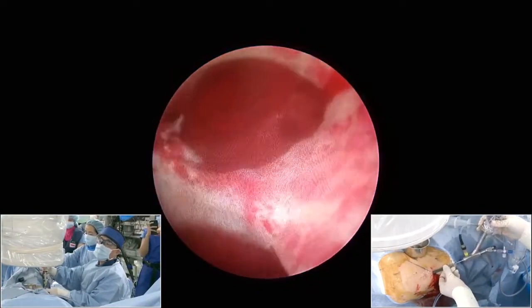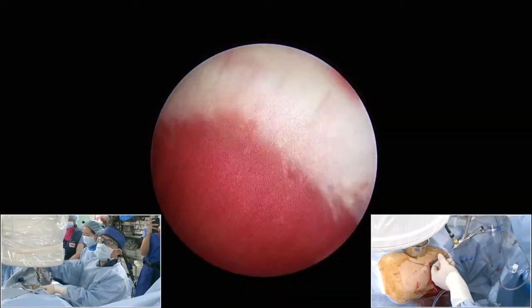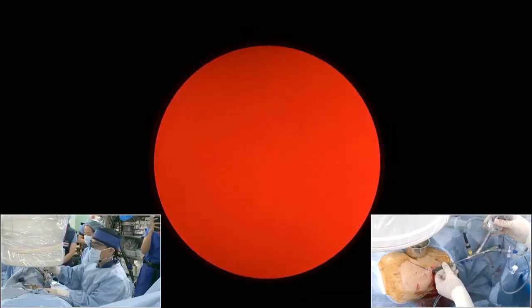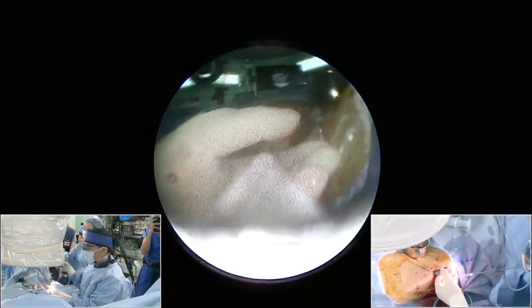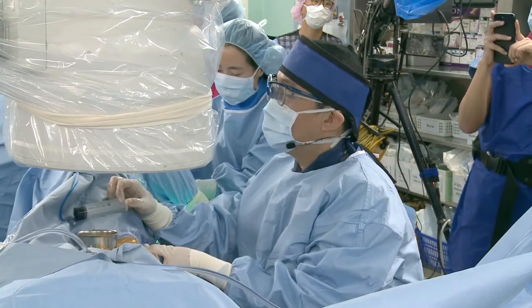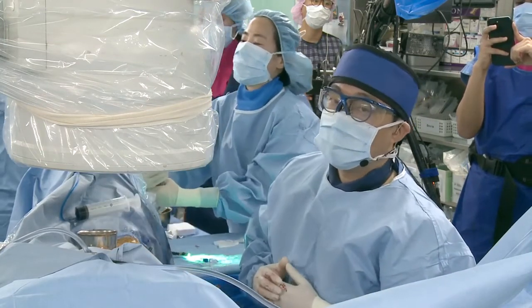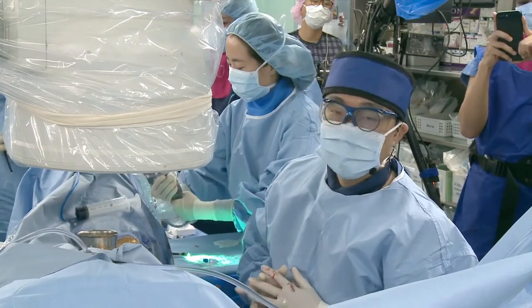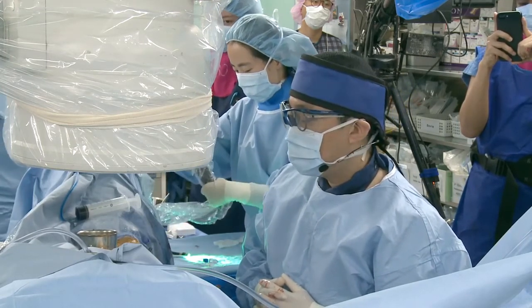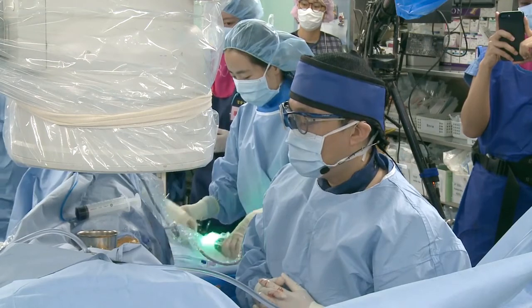Okay. So, Olivier, you prefer flexible cystoscopes, which are used as nephroscope, or a digital ureteroscope? So, we have 1 minute left. Yes, so we need to finalize your session there. Do you have any final remarks on your case or on your strategy before we leave you?